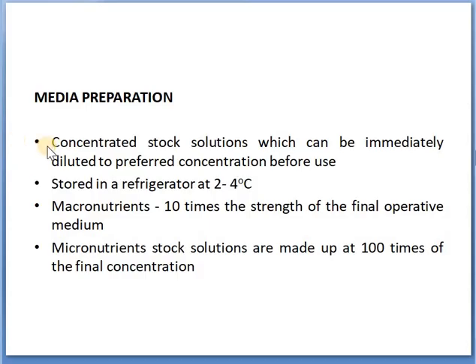The stock solutions are stored in a refrigerator, generally at 2 to 4 degrees. Some of the components, for example stock solutions of micronutrients or even vitamins, usually are stored at -20 also if they need to be stored for a longer time to preserve their stability.